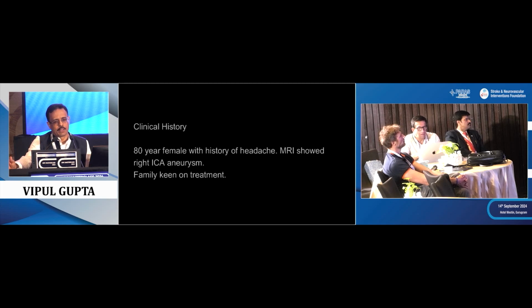That's an important point. And Tufil made an important point. I may be happy showing, look, it's largely gone. But as long as any aneurysm remains unruptured, we are in the danger zone, right? And that's an important message for us to carry, that we can't ignore that point, that there is still some small amount of residual aneurysm.